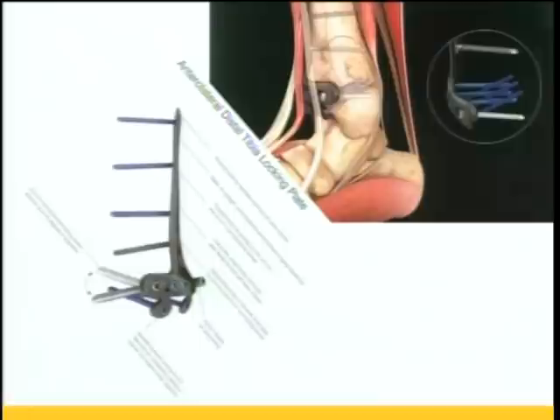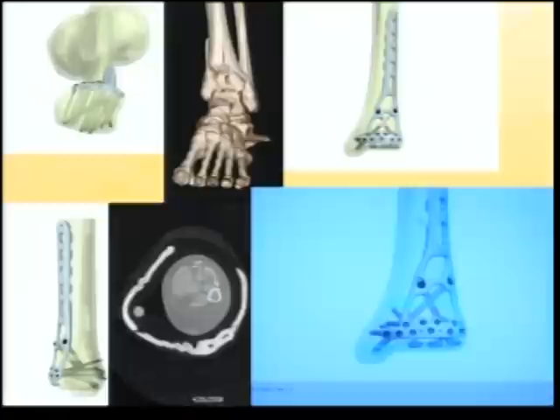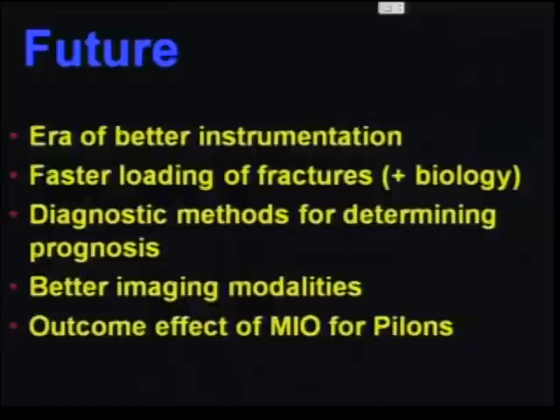And this is one that I particularly was intrigued by because it addresses that anterolateral comminution. You saw in the last talk a lot of mini-fragment fixation, which is really not buttress, and I've done plenty of those cases myself. And this is a plate that I think will address all the elements of that pilon map, the fracture data that comes from that. So I think things are happening in the pilon world to bring us to a more minimally invasive mindset, which is a healthy culture, but I think we will also learn some hard lessons.